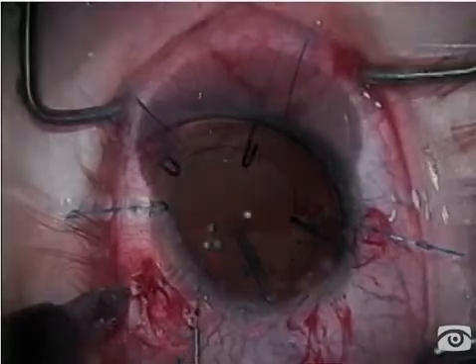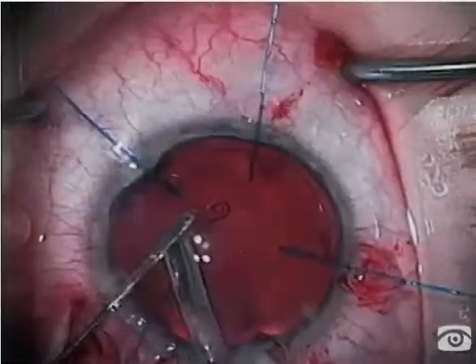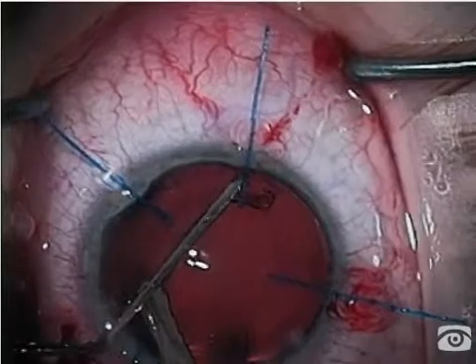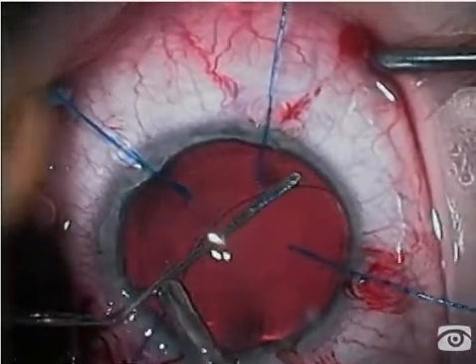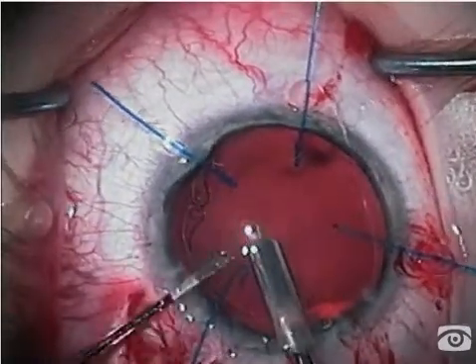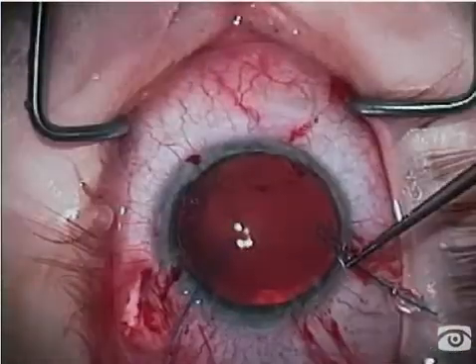Now we're going to re-expand the bag and prepare for a Sioni fixation ring. First, I'm going to place an ordinary capsular tension ring. Even though the diameter of this bag is very small, we know that the ring will simply be compressed and the two eyelets will ultimately be overlapping.